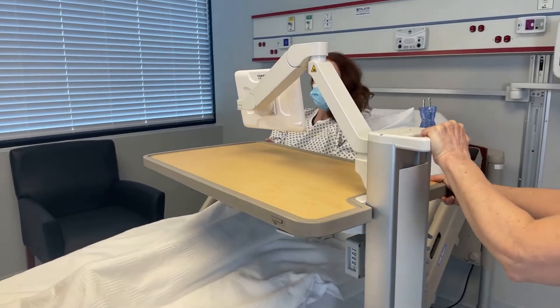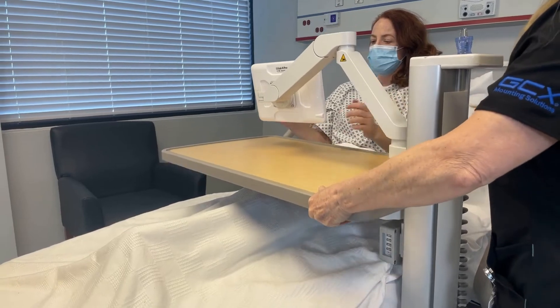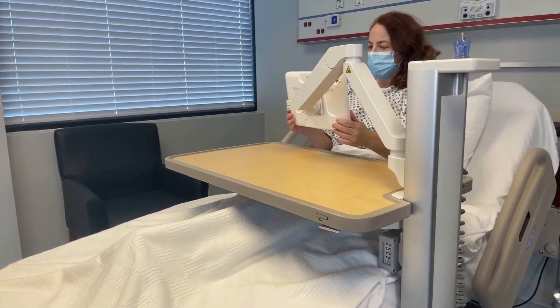Should you need to replace your overbed table in the future, the VHMT is compatible with the award-winning GCX patient overbed table.